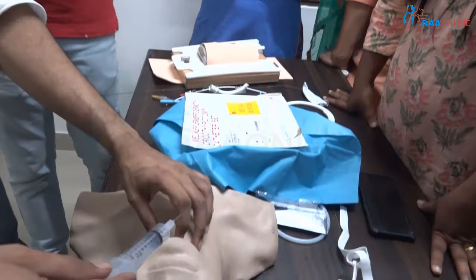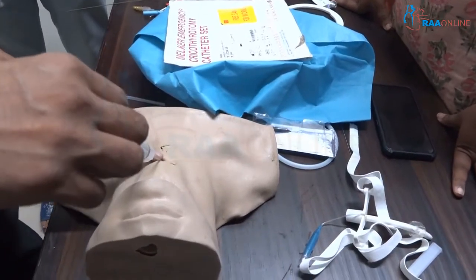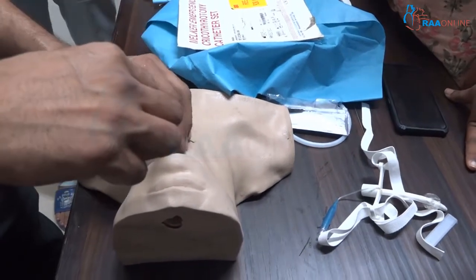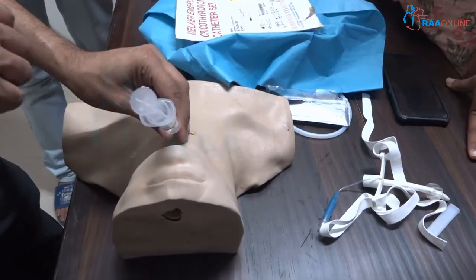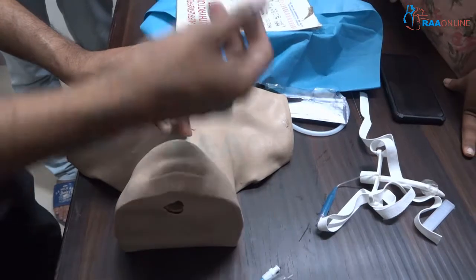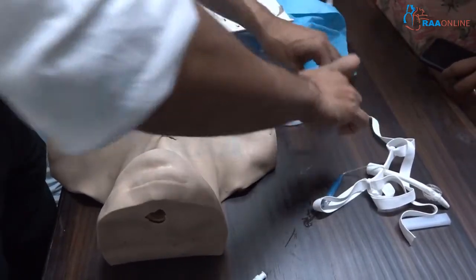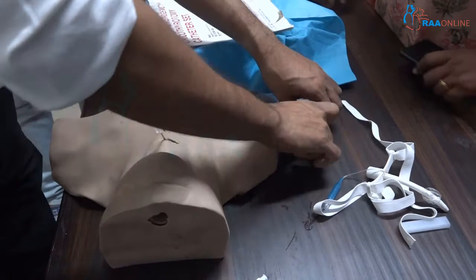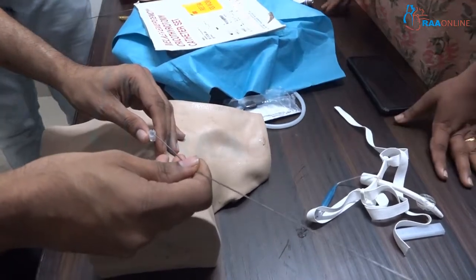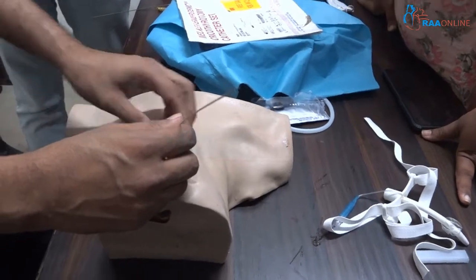Palpate the cricothyroid membrane using the laryngeal handshake. Once you reach the membrane, puncture it. Once inside, you will get a loss of resistance — aspirate for air. Remove the needle and insert the J-tipped atraumatic guidewire.